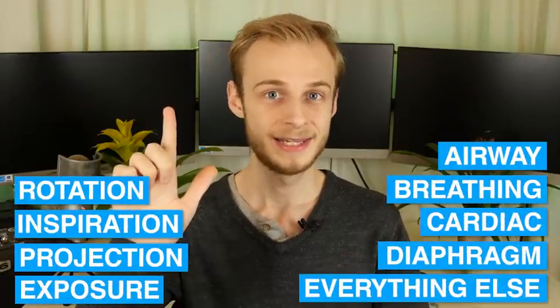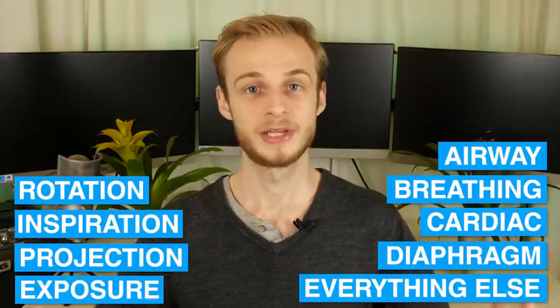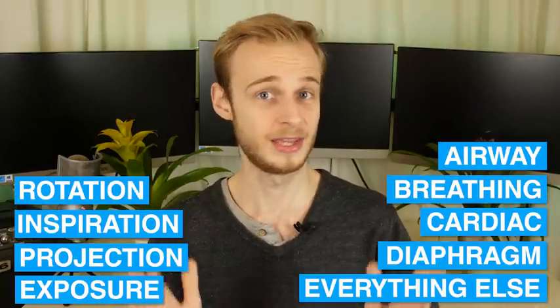Okay, good. But you might have some who want you to go through that very formulaic approach to say what you see, and having that structure means that you don't get lost and you don't miss things, particularly when it comes to an exam. So you only need to remember RIPE, A, B, C, D, E, and that will get you through interpreting any chest X-ray that you come across.